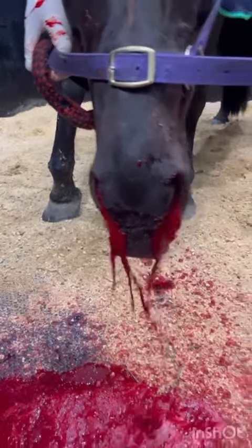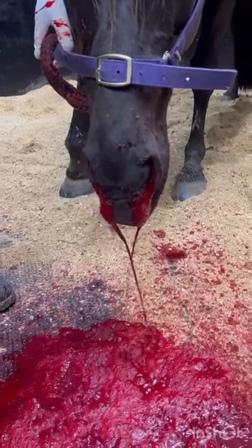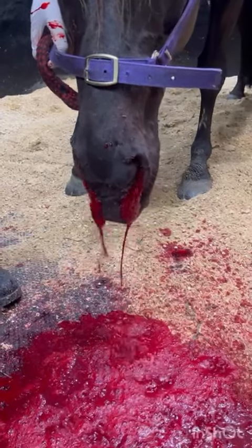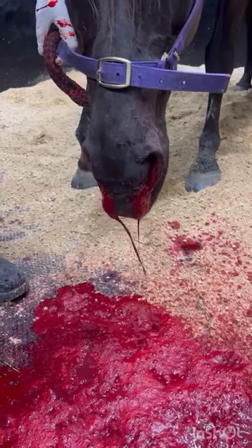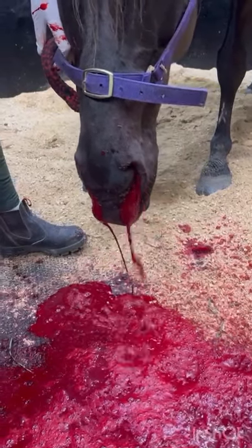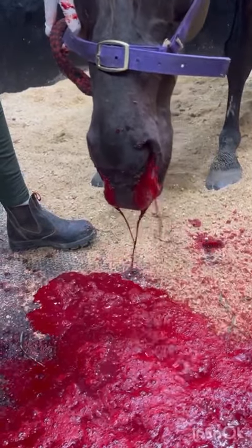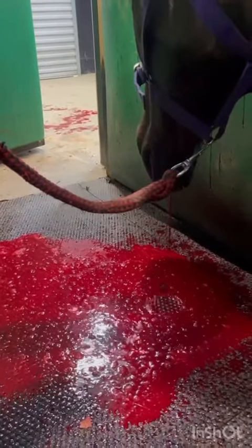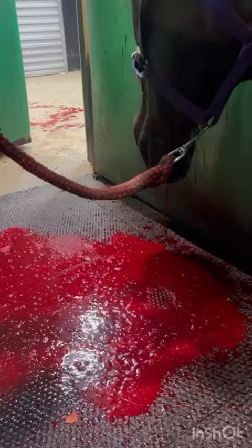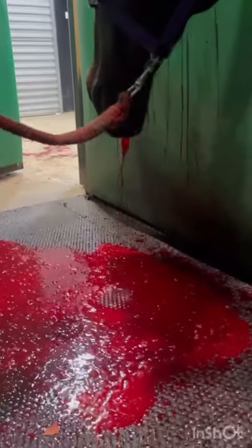This horse has a condition called guttural pouch mycosis, which is a fungal infection in its guttural pouch up in its head. That fungal infection has eaten its way through a very major artery leading to its head. This horse needs emergency surgery, but it's obviously losing an awful lot of blood, so we have to do a blood transfusion before we can take it to surgery.